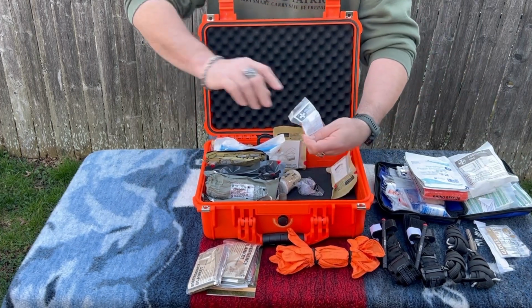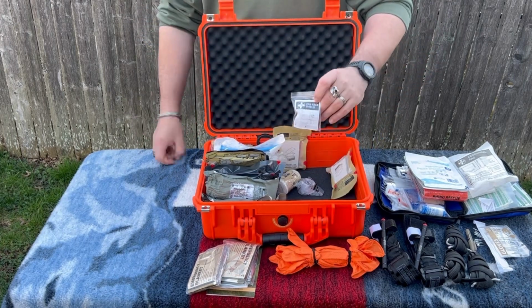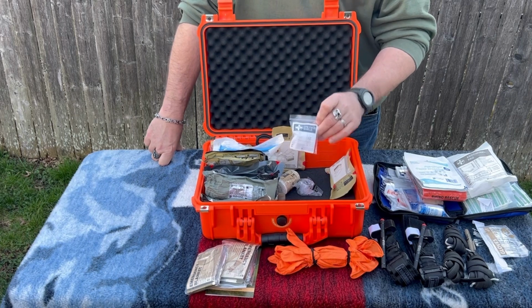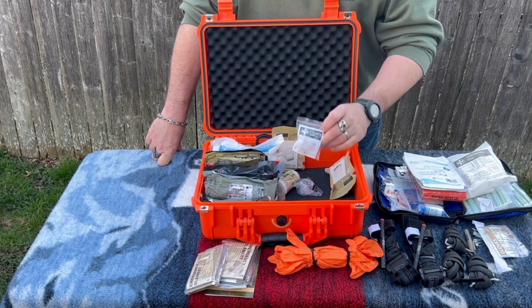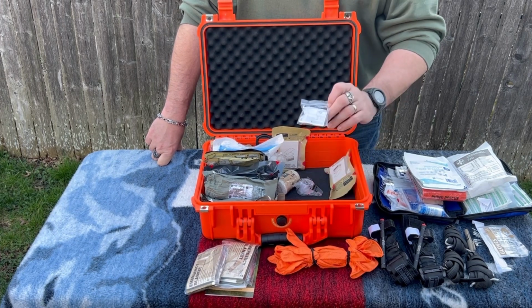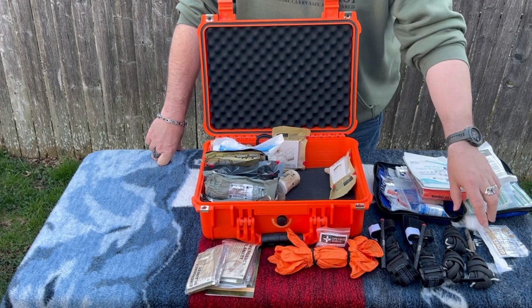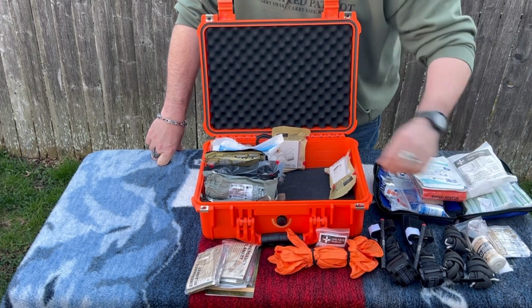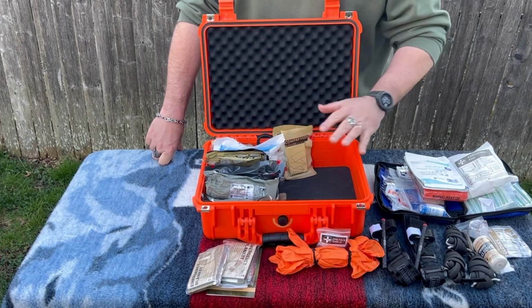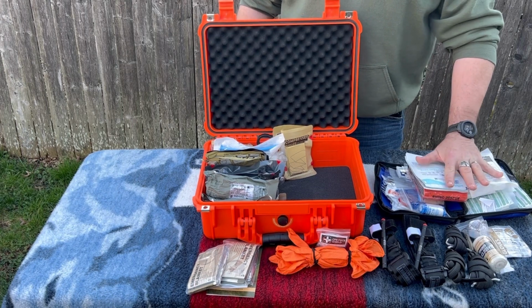This is a CPR face mask. So if you have taken CPR, you understand there's a back and forth right now between whether breaths are worth the risk or not. So there's that. Also, just in general, it's a good idea, this is another protect yourself thing. Surgical tape. And this is an elastic, like an ACE bandage. And that pretty much encompasses everything that's on the first aid department that's here.